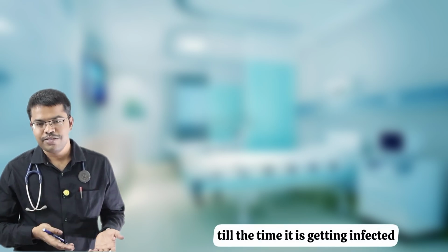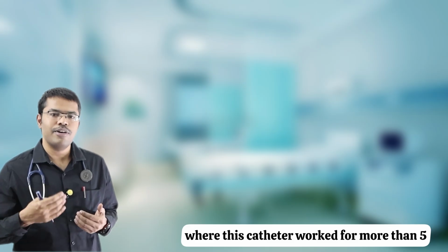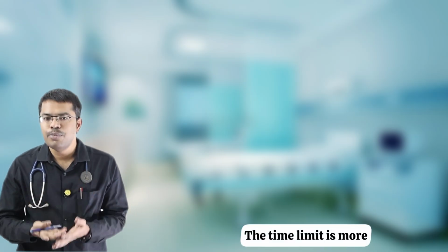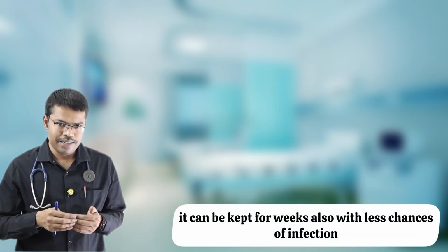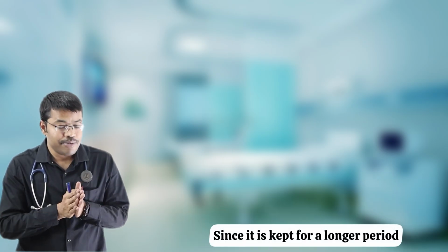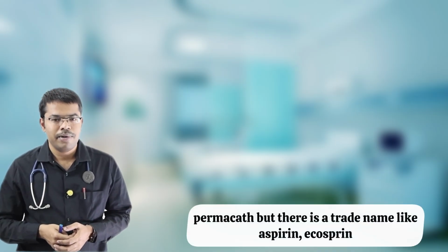How long can it stay? Till the time it is getting infected. I have seen patients where this catheter worked for more than 5, 6, 7 years. The time limit is more. So there is an advantage. Not only for years, it can be kept for weeks also with less chance of infection. Since it is kept for a longer period, that is why the name Permacath.